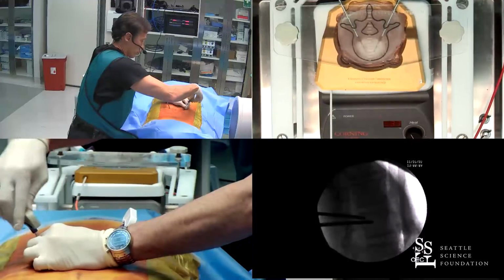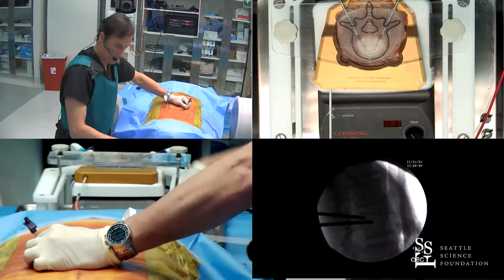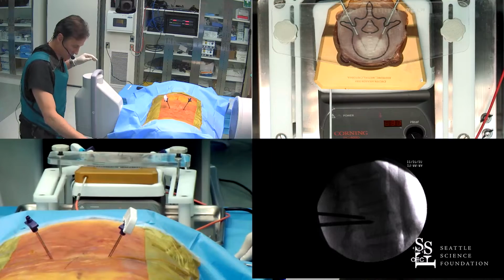Can we get another lateral? It seems the photo, yeah, let me reshoot that. It's dark.